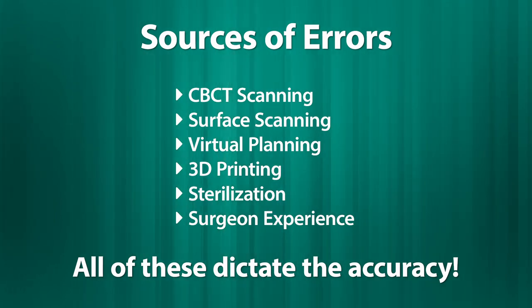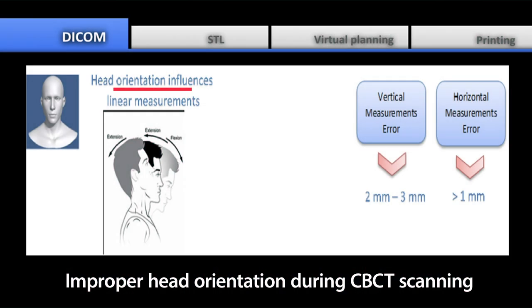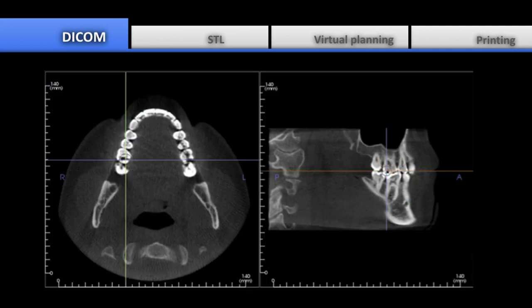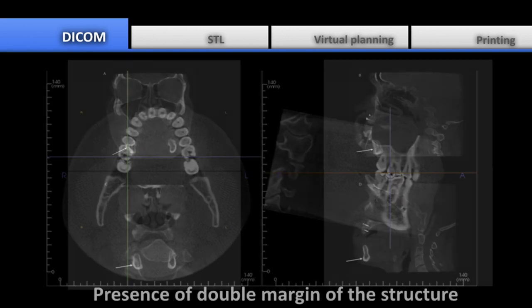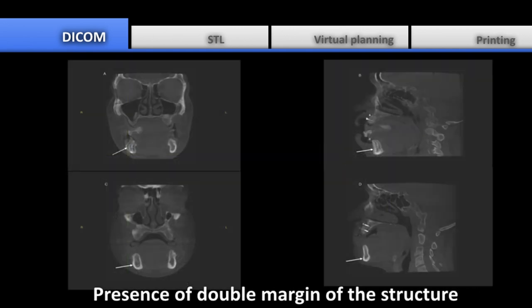So during CBCT acquisition, head tilt could be a source of error as it can lead to a vertical measurement error of 3 mm and a horizontal error of around 1 mm. This is a correct head position and this is a tilted head position. Also, double margins of the bone due to patient's movement during scanning. It would be difficult during virtual implant planning to know which margin is the correct one.